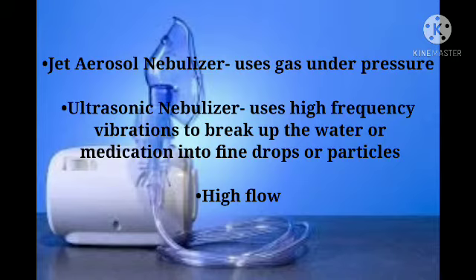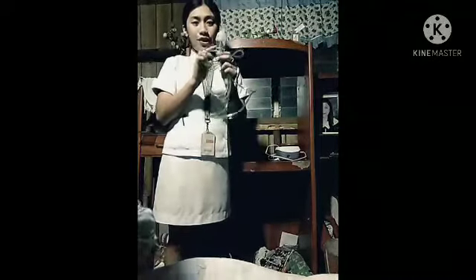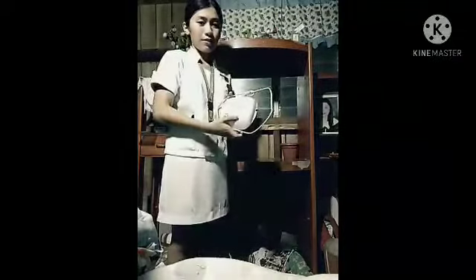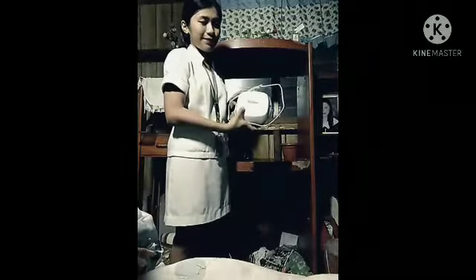High flow. Equipment. Mouthpiece or appropriate oxygen mask, for example a Hudson mask. Prescribed air supply, piped in cylinders or via portable air compressor. Adapter, nebulizer apparatus or machine. Prescribed medication if dilution of drug is required. Sodium chloride 0.9% normally being used.